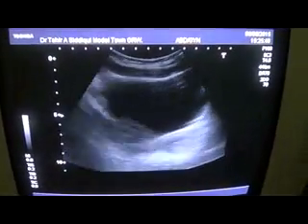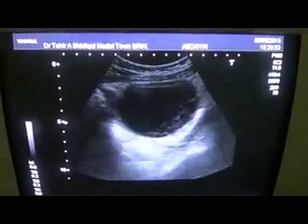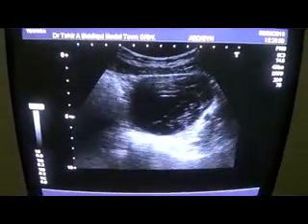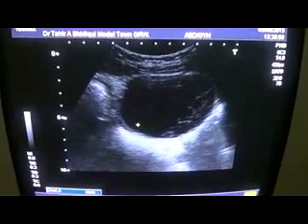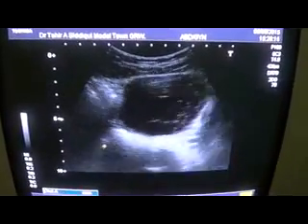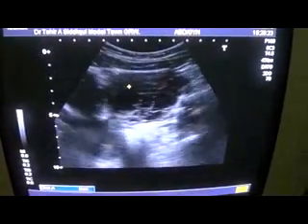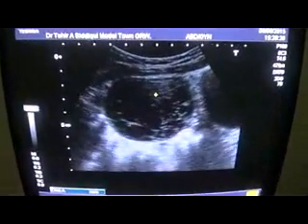This is the urinary bladder, and here on the left side, when I move the probe towards the left adnexa, I see this cystic area. If you want to study the cystic area, it fulfills the definition of a cyst. See, it's thin walled, and you see the posterior wall acoustic enhancement, or strong back wall, in this area. And internally, as I have just told you, these are thread-like, linear structures. These are all septa within the cyst under study.